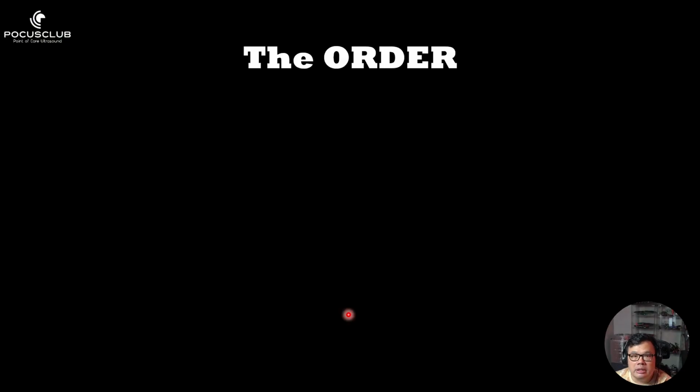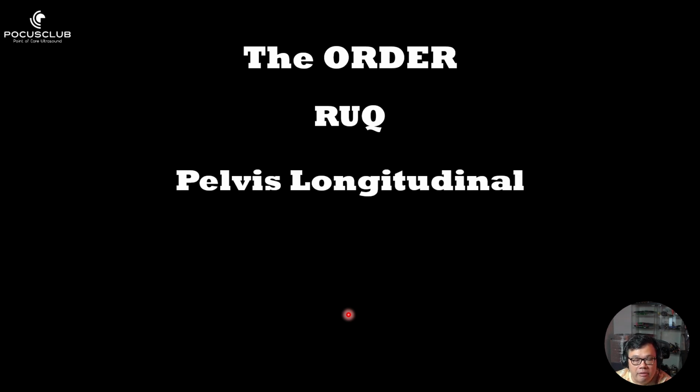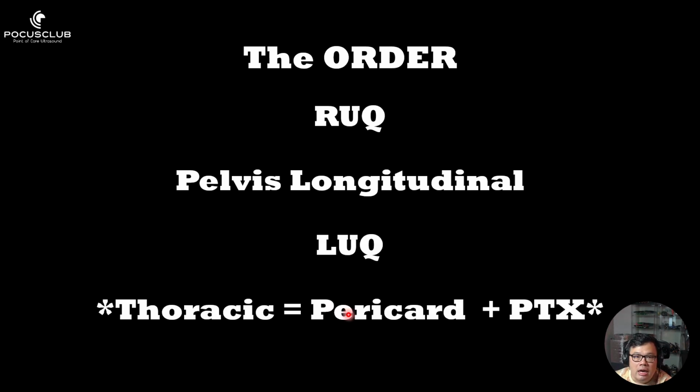So the order is entirely based on your injury pattern. If it's mostly abdominal pathology you're dealing with, you start with the abdominal compartment. If it's in the thoracic compartment, you start thoracic, obviously, first. Okay, so in the abdominal compartment, if you're going to start it this way, right upper quadrant followed by the pelvis in the longitudinal fashion, then the left upper quadrant, followed by the other exam, which is the thoracic component.